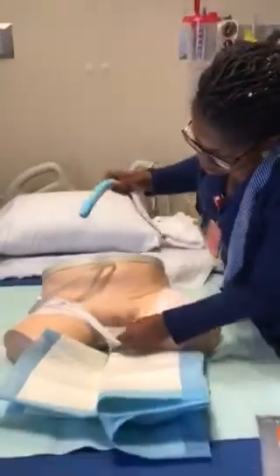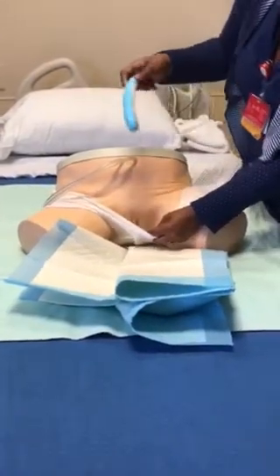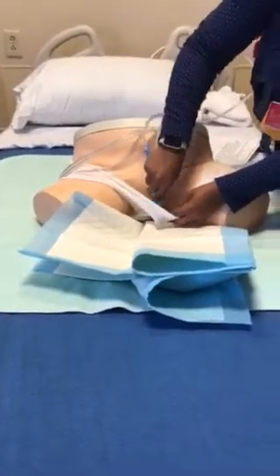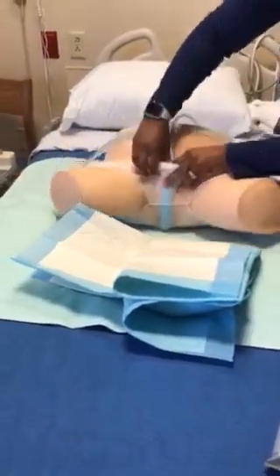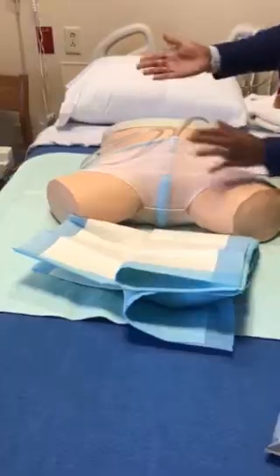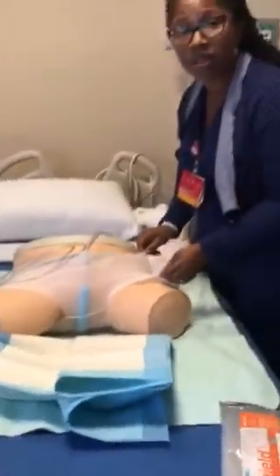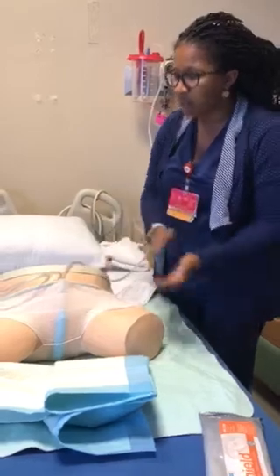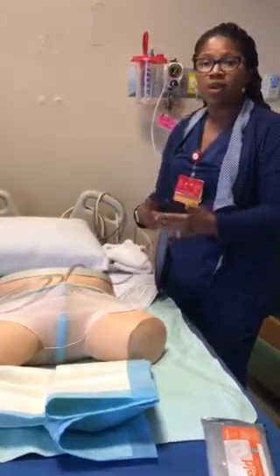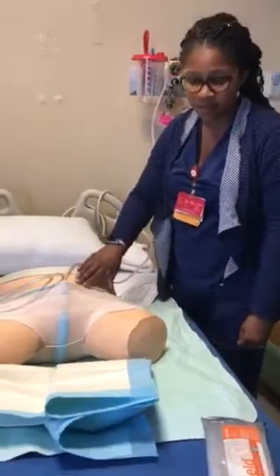The way that it is placed, you're going to use the patient's anatomy to hold it in place — between the labia and the gluteus, right there at the area. For our smaller females, we can use mesh underwear to help hold it in place. For some of our larger ones, once we close their legs, there hasn't been a problem with it moving. Patients that are moving around or confused won't be a candidate either, because they won't be able to hold it in place.